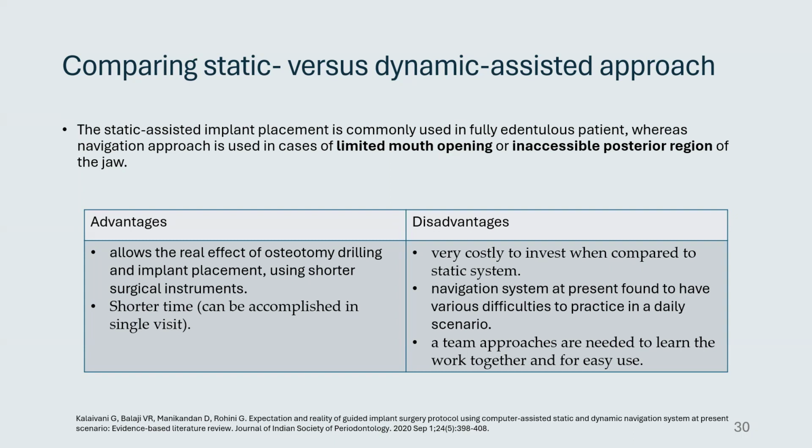We view the field through the screen, so we don't need the patient to open wide. Okay. The advantages are that it allows, as we said, real-time tracking of the osteotomy drilling and implant placement using shorter surgical instruments in shorter time.